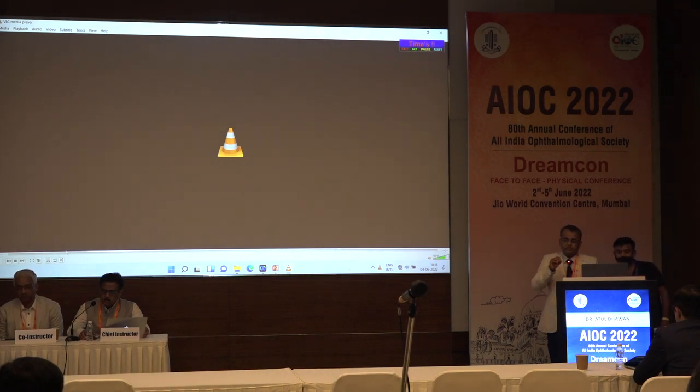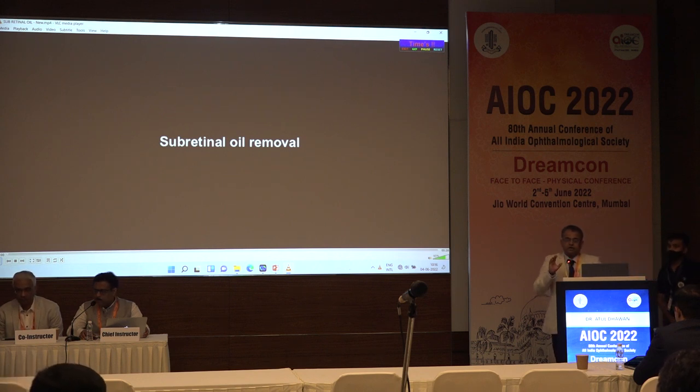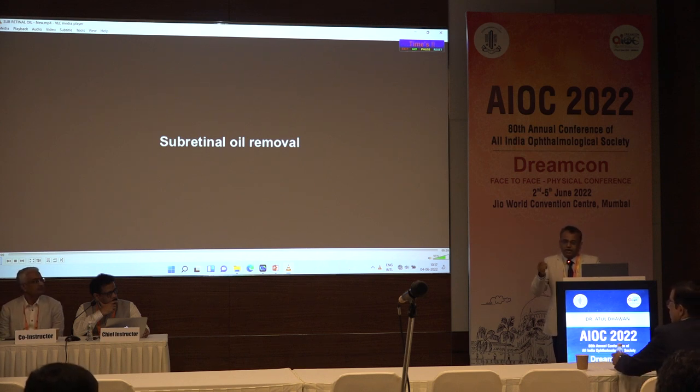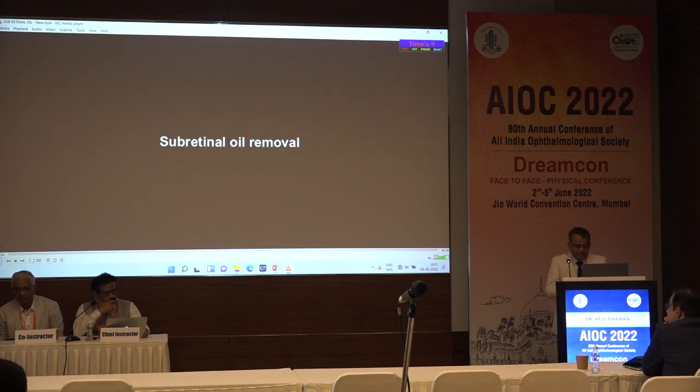In this case also, at the end of the surgery, I found a bubble of oil inside the subretinal space. So what I did was push saline into the subretinal space, and because my retinotomy was on the superior side at around the 12 o'clock, I chinned down, and because of this, the water went towards the 6 o'clock and the oil came towards the 12 o'clock. Just see how I have done this surgery, a small part.